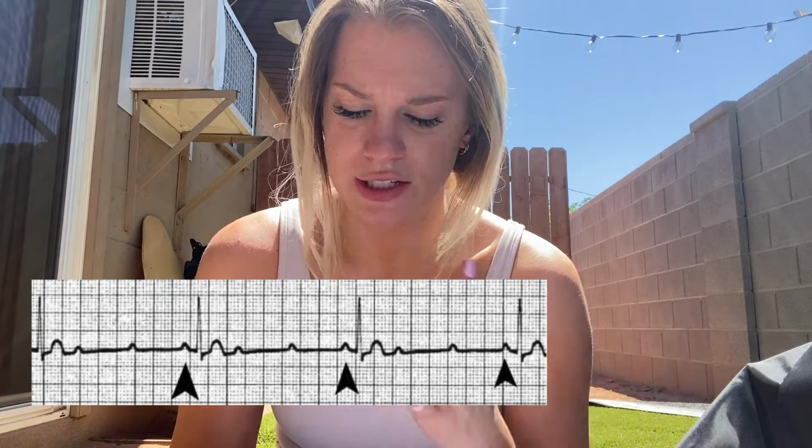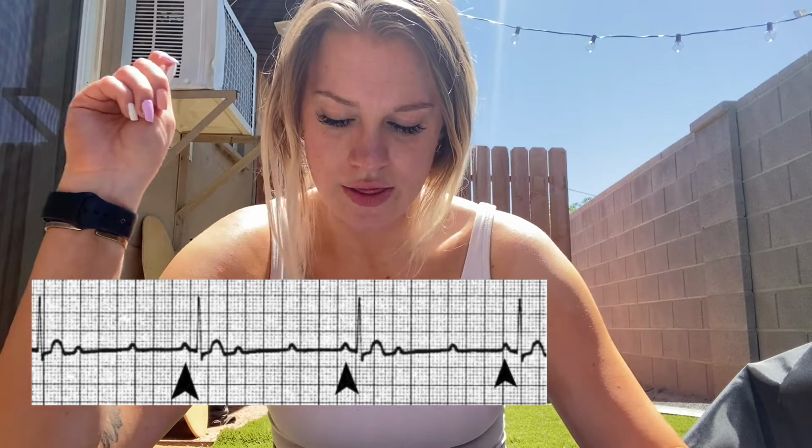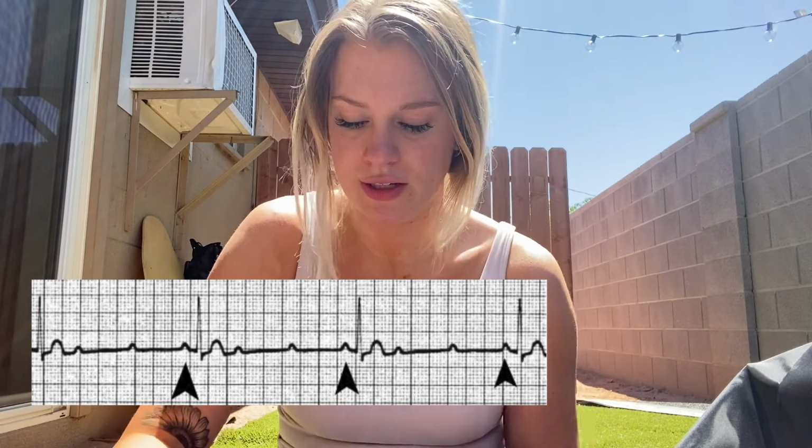Then let's go over the second degree AV block type 2, and I'm like 99% sure it's called Mobitz 2. So Mobitz 2, y'all. This is getting into the ventricles, and this is getting dangerous for the patient because you do not want to have a ventricular block. You just don't. The defining characteristics of this one are that there is a pattern. It's going to have equal PR intervals, but there's going to be extra P's.